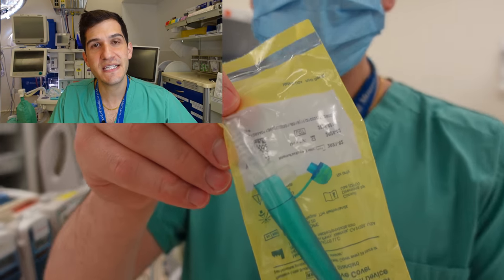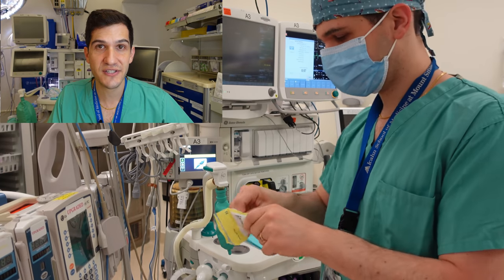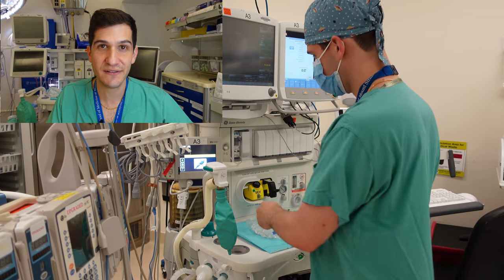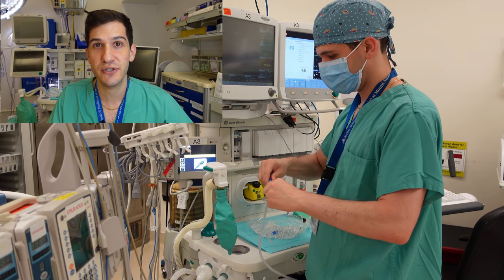The S in the mnemonic stands for suction, and in this case I'm picking out one of our smallest suction catheters. You can see by comparison it's significantly smaller than the suction used for adult cases.